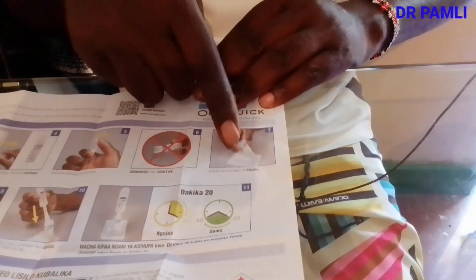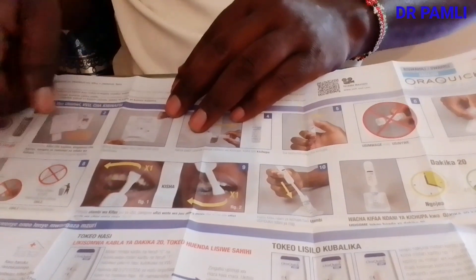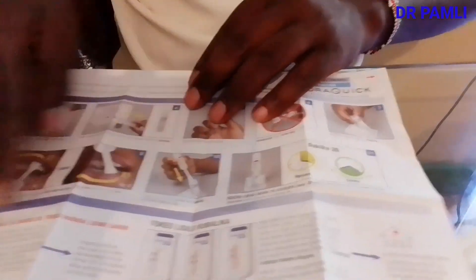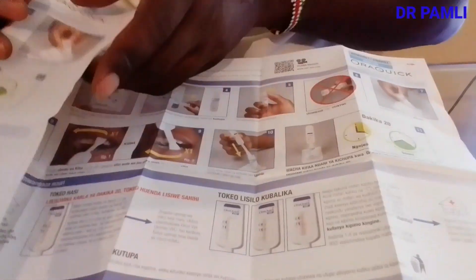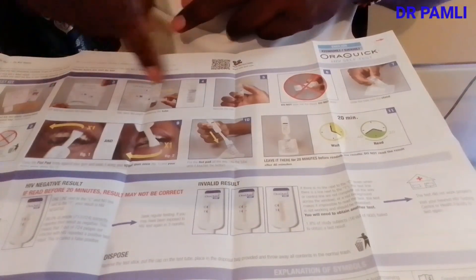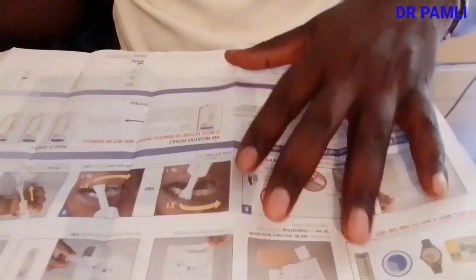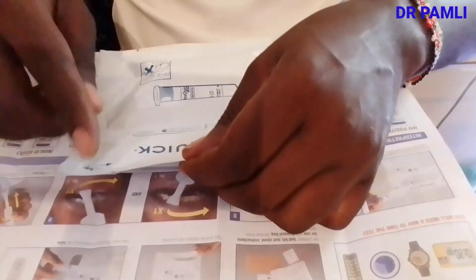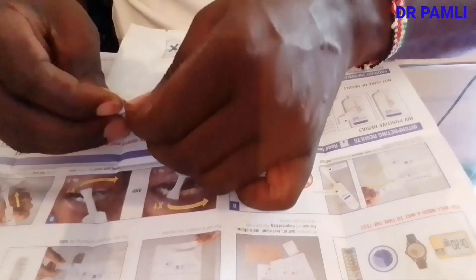What I like about OraQuick is that the instructions are displayed in a pictorial manner. This self-test kit has instructions in both English and Kiswahili, which is very important for Kenyans. The pictorial guide shows how to interpret results — HIV positive, HIV negative, and invalid results — and also how to dispose of the used materials. There is also product information on how to use the OraQuick self-test.